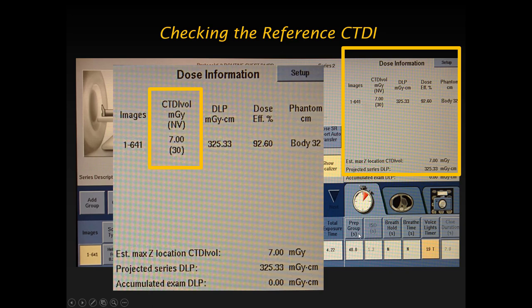This is the average exposure. All of your scan parameters, your kV, your rotation, your pitch, your filter, everything essentially is summed up into an average here. And so this is what you're going to use to identify whether or not you're in the right range.